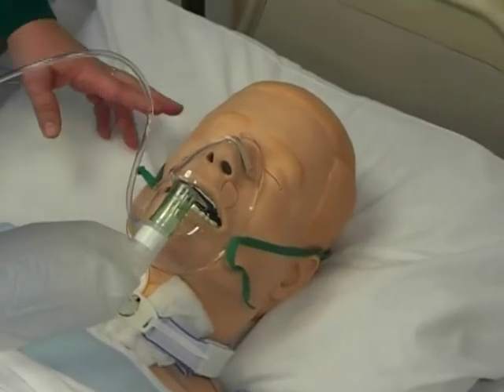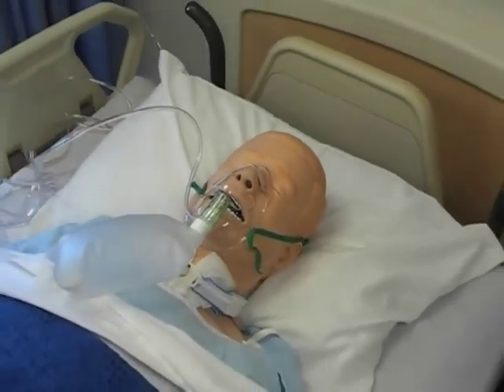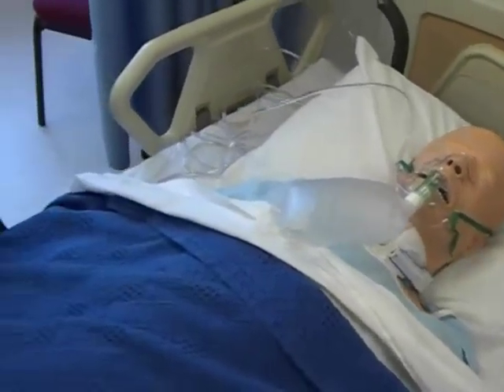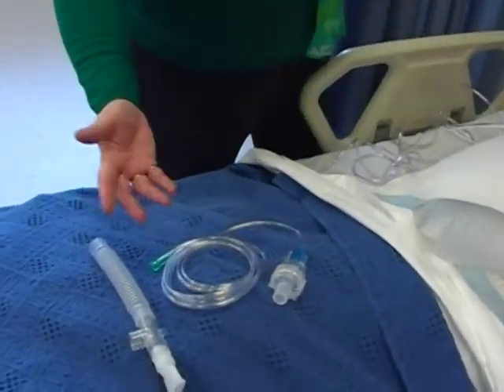Again, like the nasal cannula, we have to be concerned with soreness developing when they're wearing a mask. You're going to be watching for anywhere that this may contact with the skin, as well as above the ear because of the elastic. And that's that. I'm going to show you now some different types of respiratory equipment that you may see while you're in the facilities.